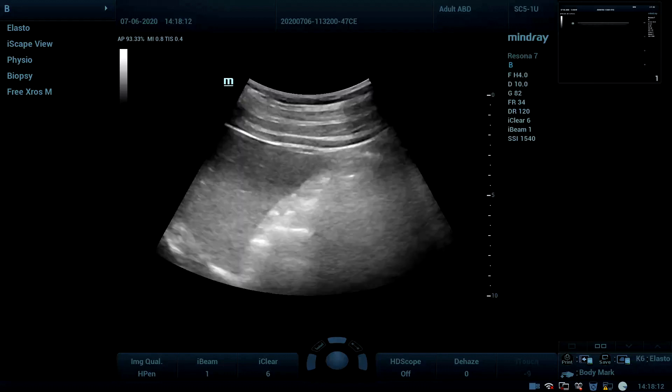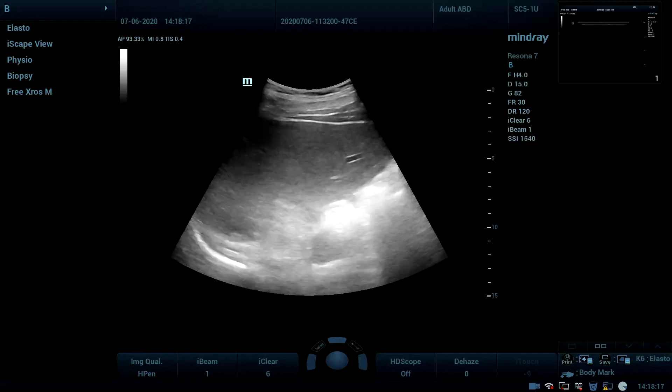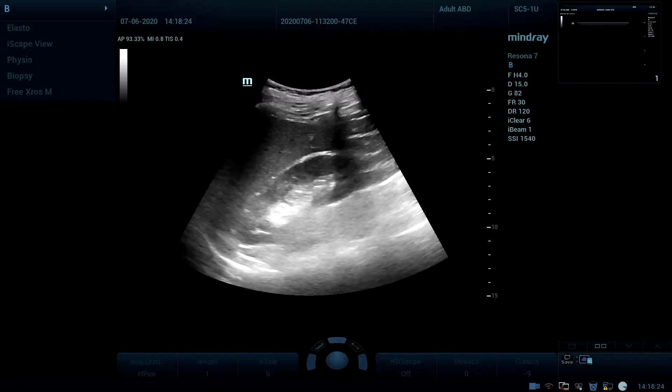Now the kidney 2D image. As you can see, the differentiation between the echogenicity of the liver and the kidney.